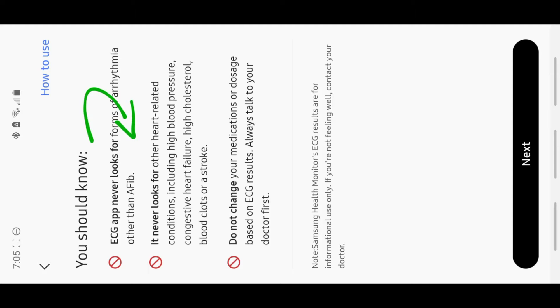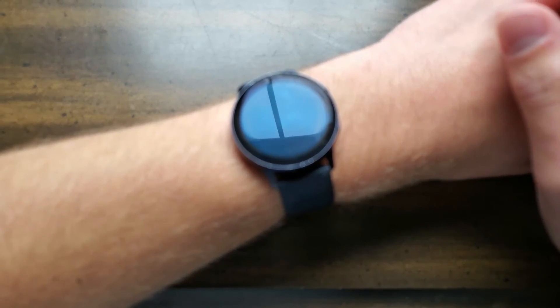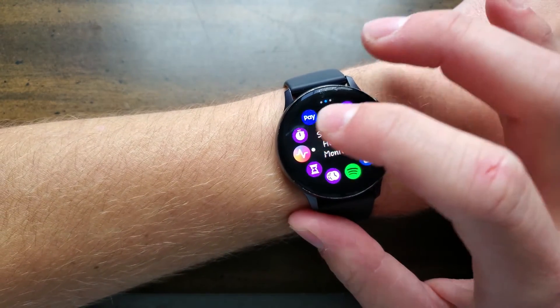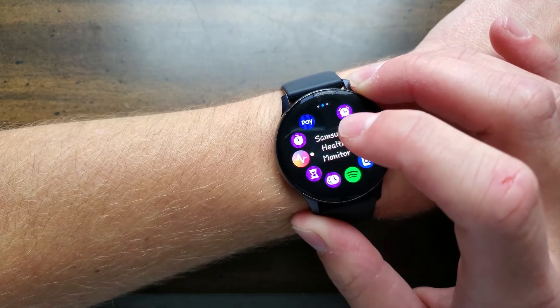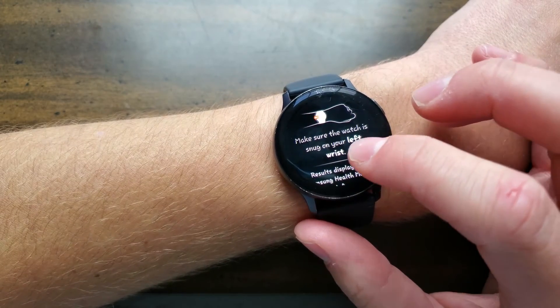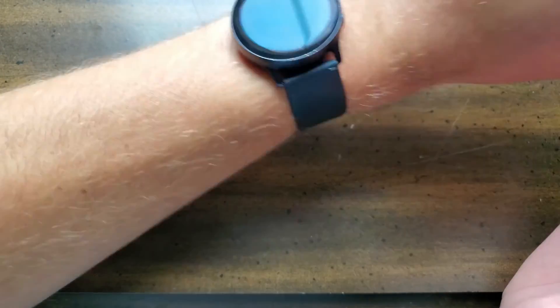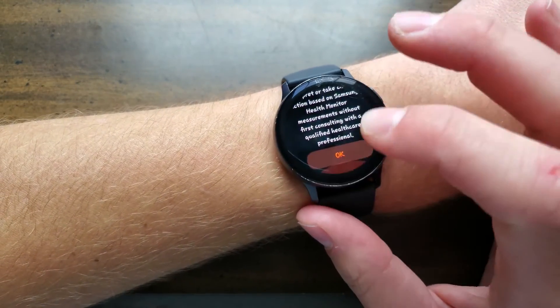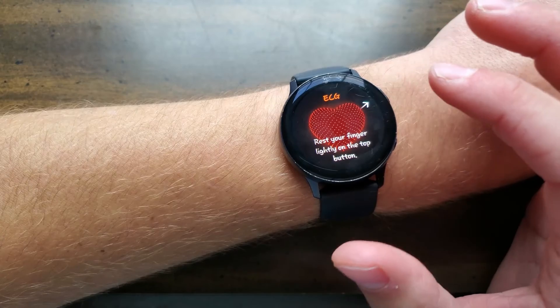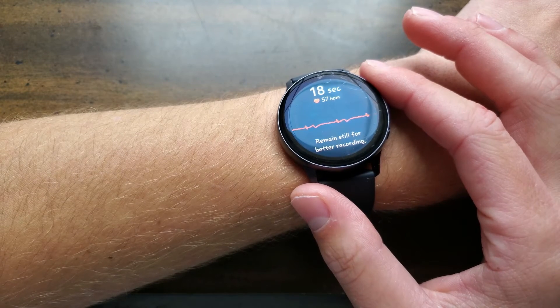I'd like to pause to read. For me, I wear mine on the left wrist. So for this to work, you're going to want to make sure the Samsung Health Monitor app is downloaded on your phone. Swipe over to your app drawer and scroll all the way over until you see Samsung Health Monitor. Once you have it downloaded, make sure the watch is snug on your left wrist — you don't want it loose and flying around. When you're ready, click OK. It'll bring up this screen that says ECG with a heart. Rest your finger lightly on the top button. The app never looks for heart attacks. This will take 30 seconds.